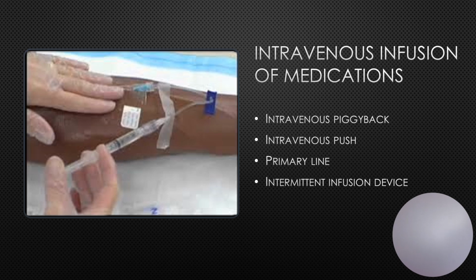Attach a second saline syringe and inject at the medication determined rate, because what's in the tubing at this point, prior or just after injecting the medication? It's going to be the medication. We want to continue to inject what's left in the tubing at the determined rate. Once we have done this for all the medications, we will unclamp the tubing and restart the infusion.